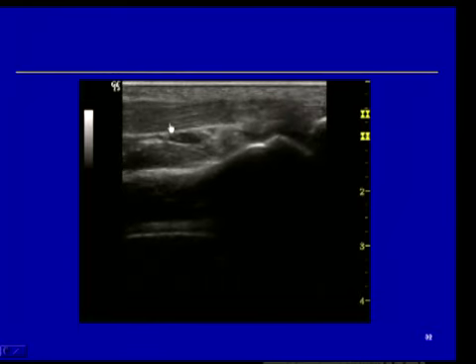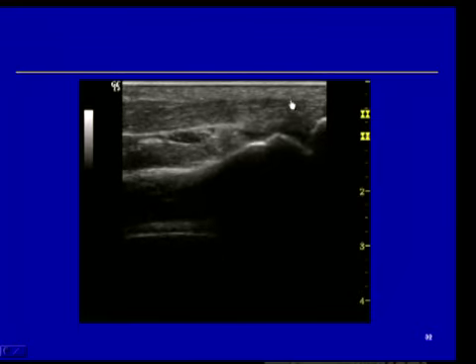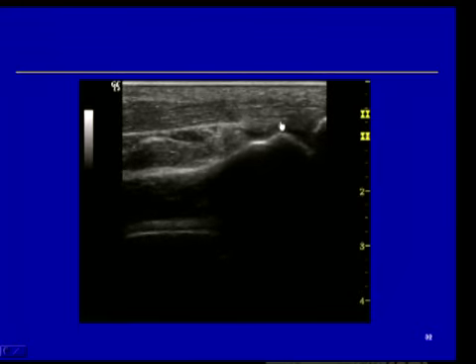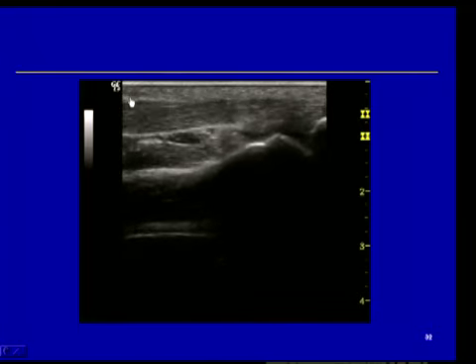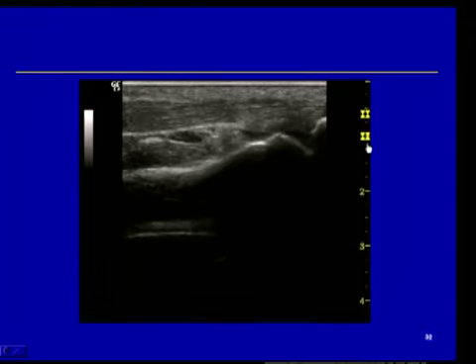Here is the flexor tendon, and it's right in this area here. You can see that there's a snapping or a popping motion, and this is where there is some triggering. So if I want to do some needle guidance intervention, it would not be at this portion. I would want to do it in this area. So the nice thing about the ultrasound, which is different from MRI, is that I can do this dynamic examination and then better target and treat my patients.